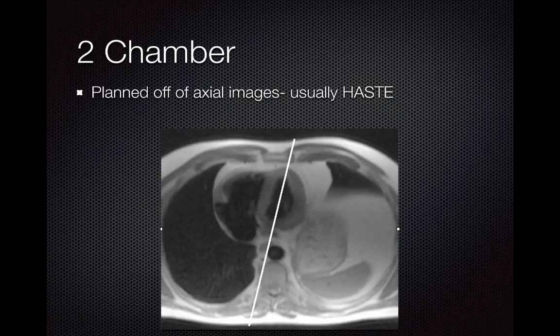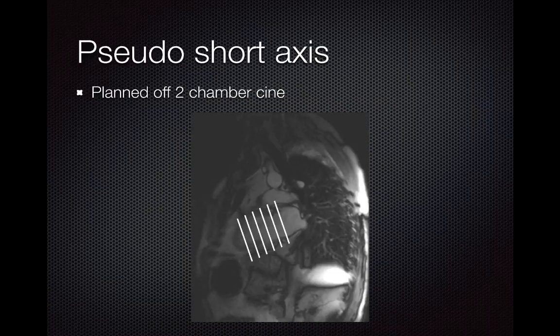We find the image in the axial HASTE stack where we can see the left ventricle nicely, then line up parallel to the interventricular septum in the middle of the LV to acquire our two-chamber view. This can be either a static image or a dynamic cine image. Here we have our two-chamber view showing the left atrium and left ventricle.